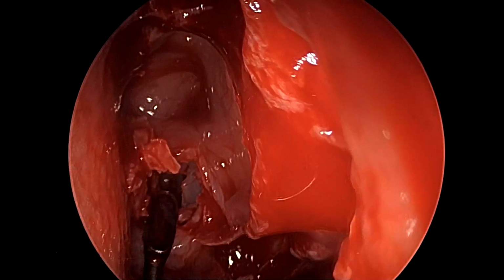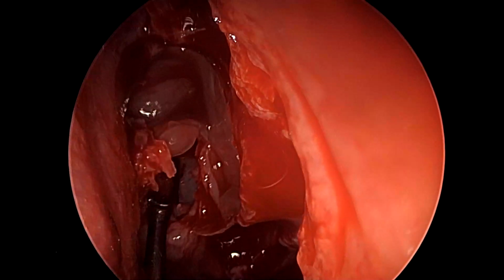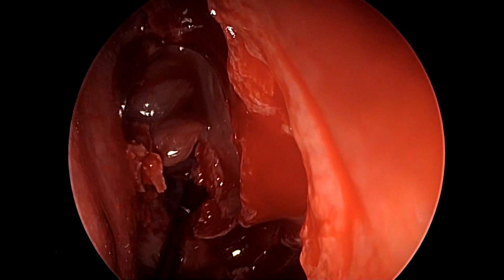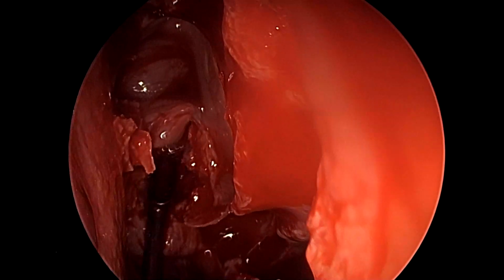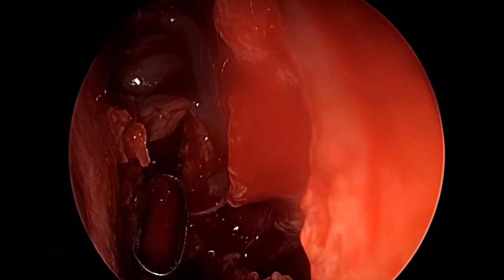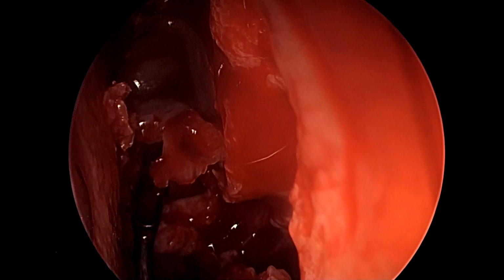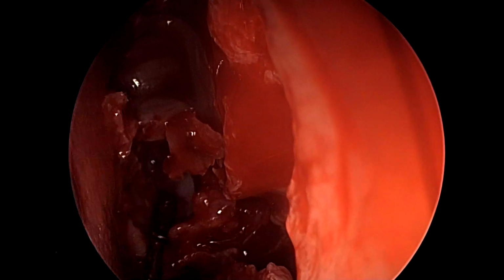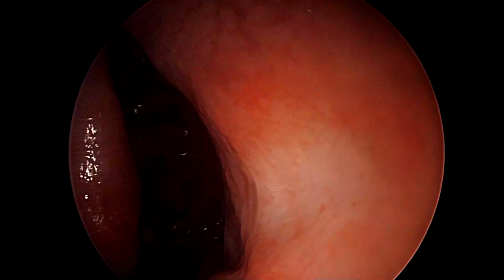Here we see that as the basal lamella was penetrated, now we are just breaking the septations using a frontal sinus curette to gain access to the meningocele both anteriorly and posteriorly. The anterior access already is there, and this is just to create a posterior access so that we can ablate or coagulate the mucosa and the bone posterior to the meningocele as well, for a sure shot acceptance of the graft material.